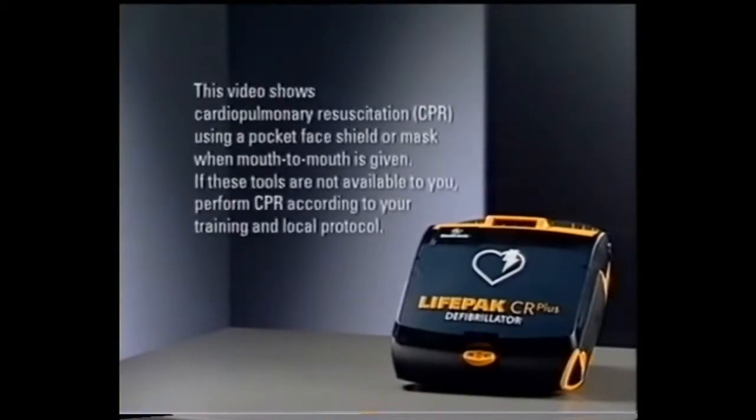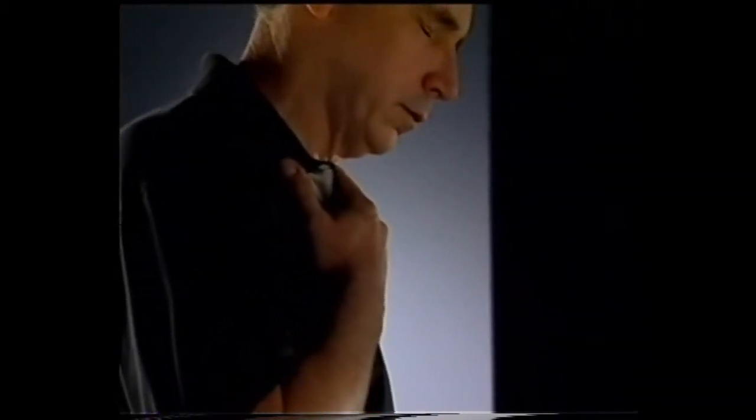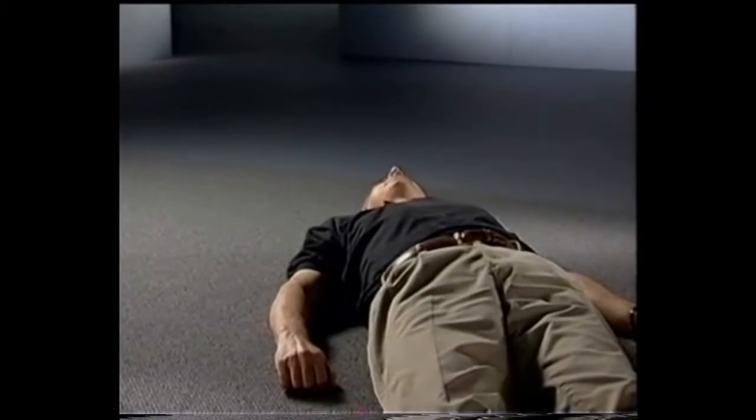This video shows cardiopulmonary resuscitation, CPR, using a pocket face shield or mask when mouth-to-mouth is given. If these tools are not available to you, perform CPR according to your training and local protocol. This is a dramatization of a sudden cardiac arrest. A sudden cardiac arrest occurs when a person's heart stops pumping effectively. The person becomes unconscious and stops breathing.